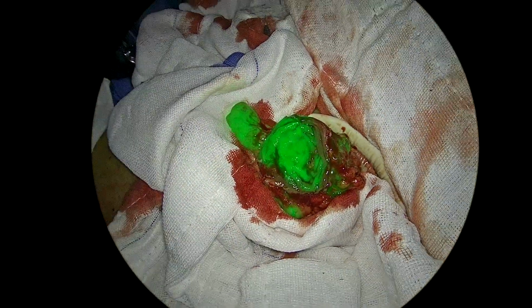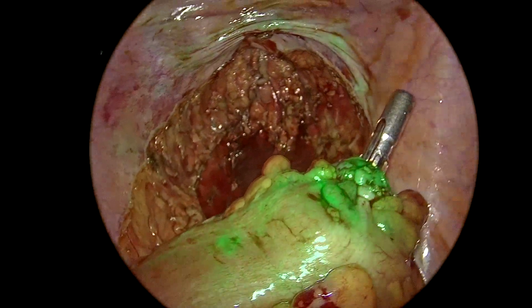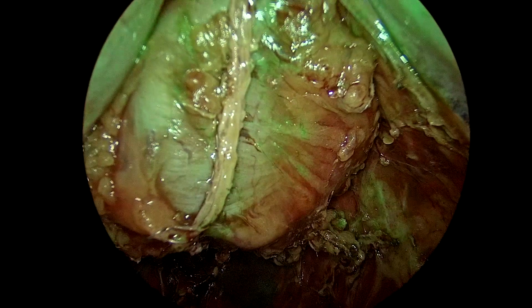Indocyanine green, ICG imaging, has been used for securing sufficient blood perfusion to the anastomotic area after low anterior resection, which is a crucial factor in preventing anastomotic leakage.